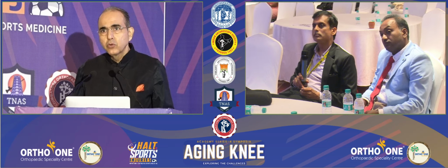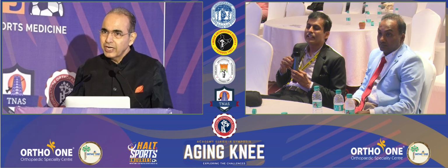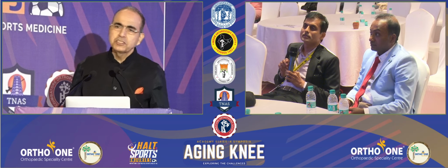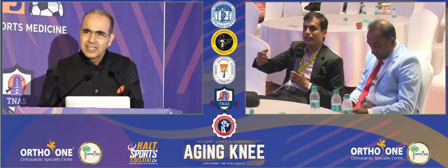But you can, Rajkumar, you have to really measure the cuts very accurately. Because otherwise you will not be able to maintain the normal joint line, and then you will have abnormal laxity or stiffness. So the message why I asked this question was, any altered alignment we try should be technology assisted. So yes, as far as possible.